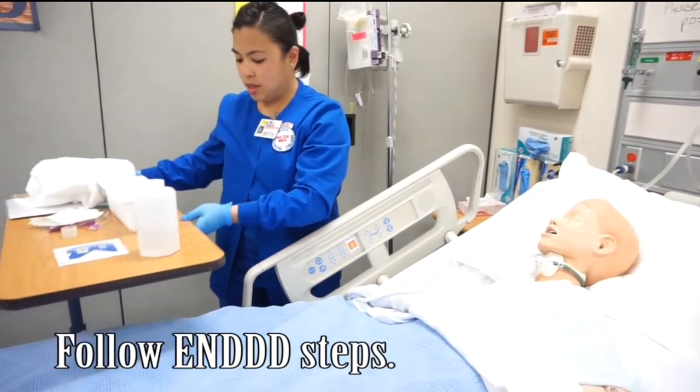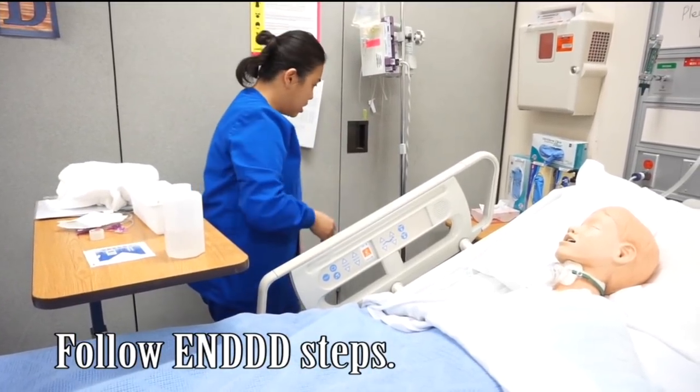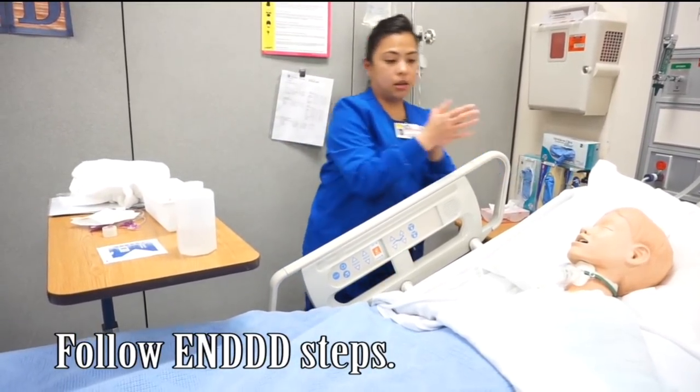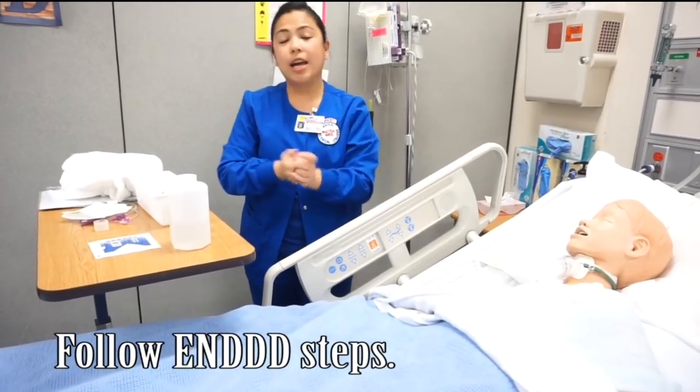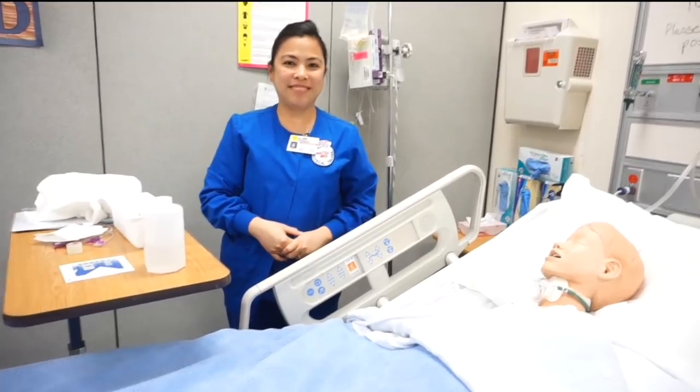And then I'm going to take this off, remove my gloves, wash my hands again, and document the procedure. And my skill is complete.